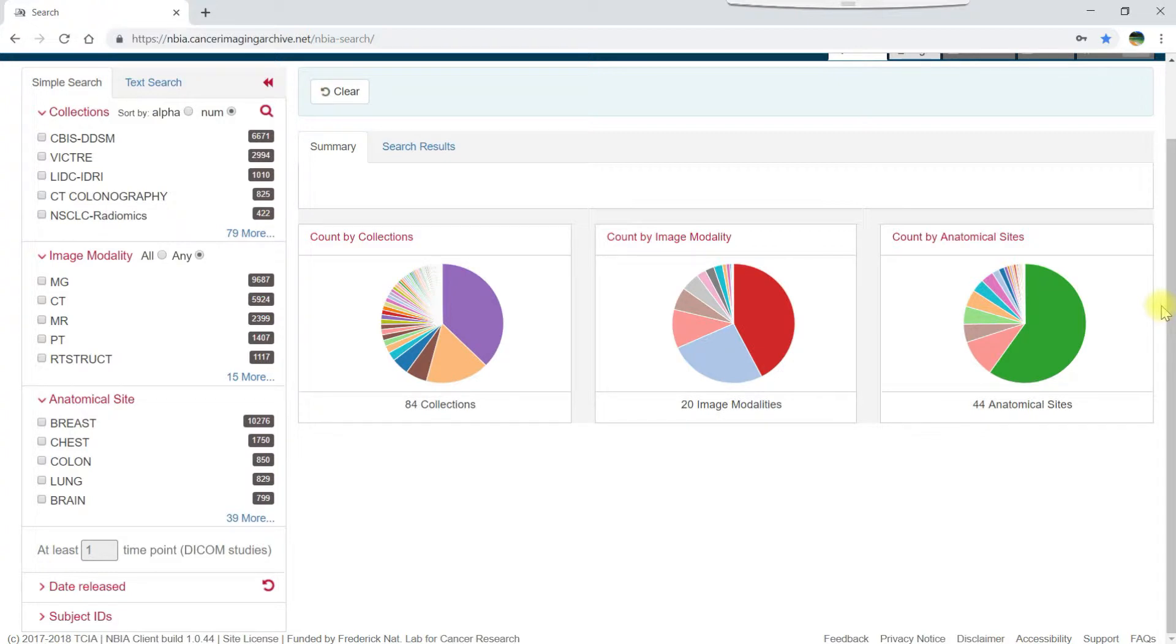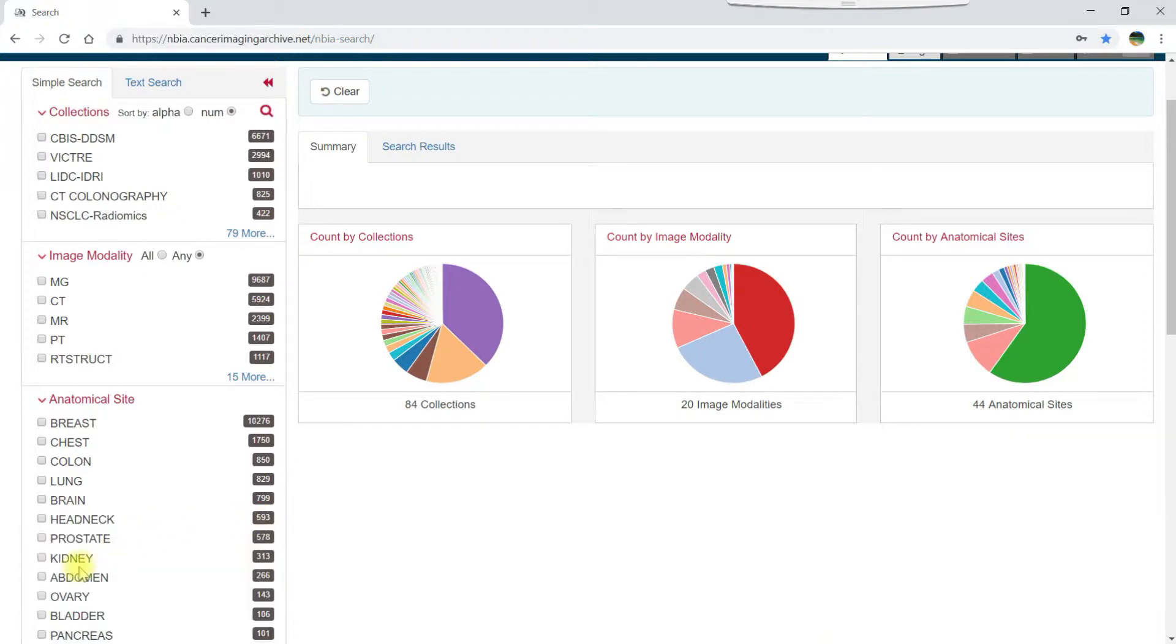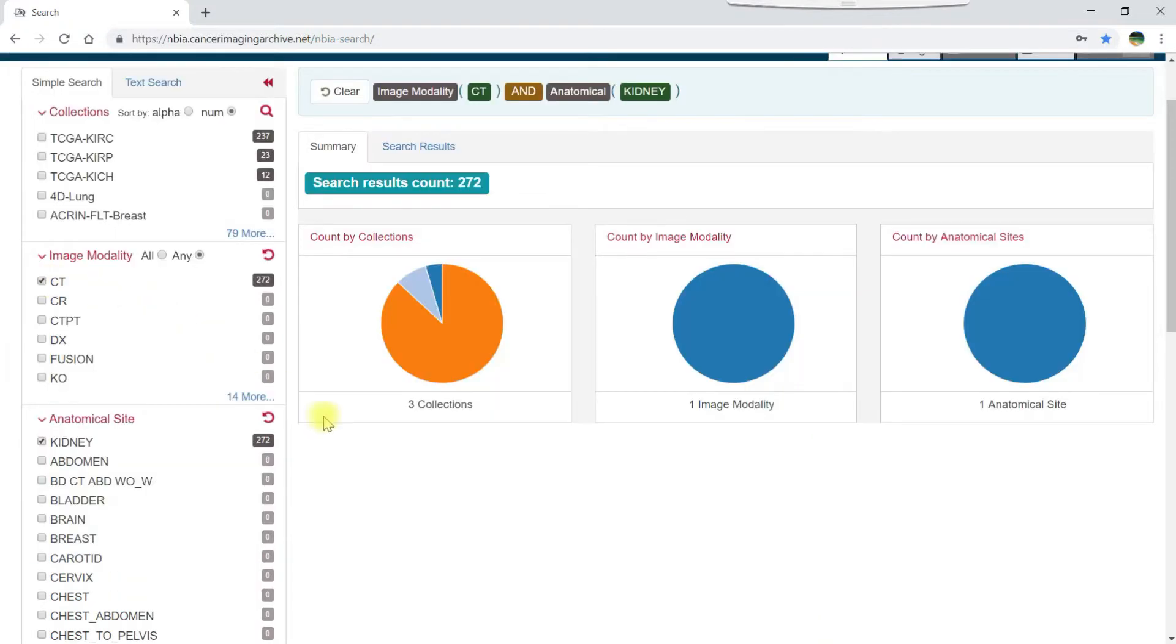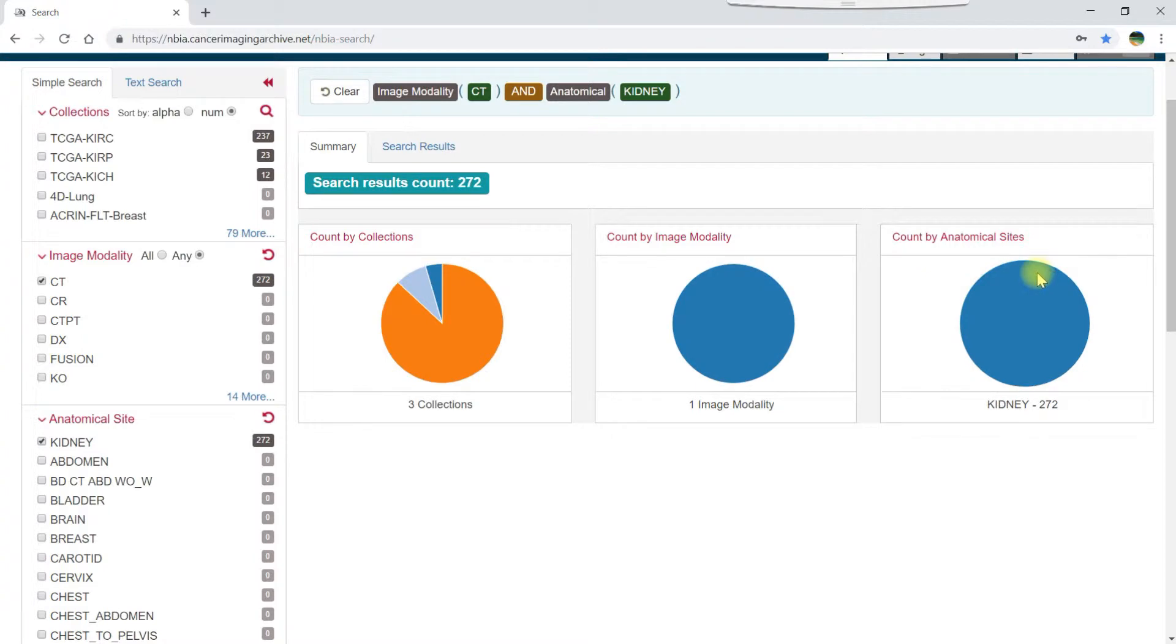Let's say we want to restrict our search to kidney scans. To do that, click the box to the left of kidney in the anatomical site section and CT in the image modality section. As soon as you select a filter, you see the pie charts on the summary tab change to reflect a summary of your search results.